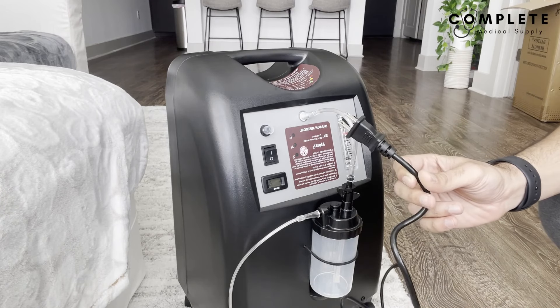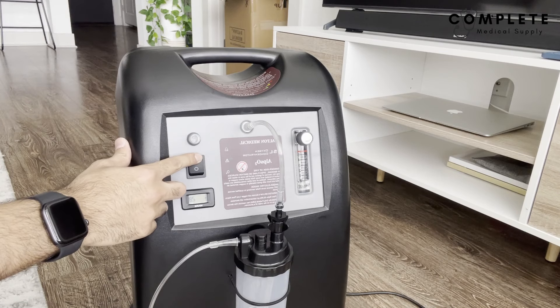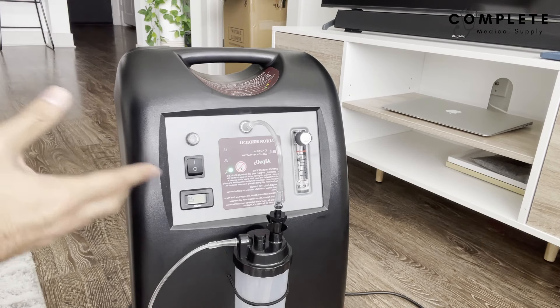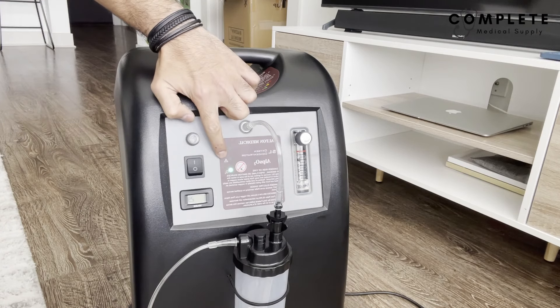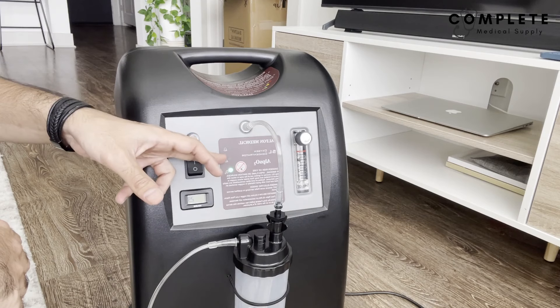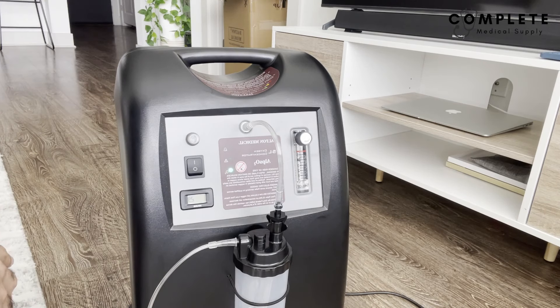Now let's turn the machine on — plug it into a power outlet and turn it on. Usually with concentrators there will be some blinking lights in the beginning; different brands will do different things, but this just means it's turning on and warming up. Let it run for about 30 seconds to a minute. When that time is up, the lights will turn to a solid green, meaning it's ready to use. If there's an orange or red light, that indicates something may be wrong — check the owner's manual first before contacting the manufacturer, as it might be something simple like the tubing not being plugged in all the way.